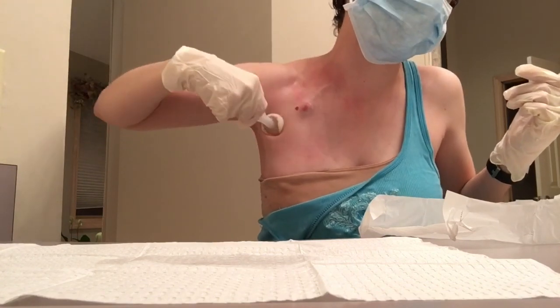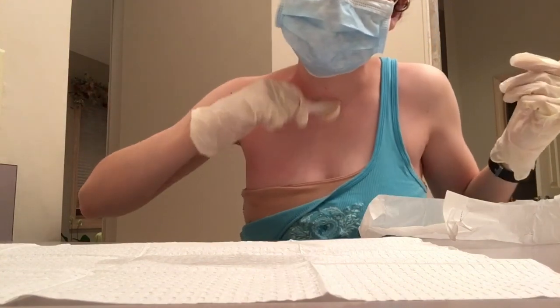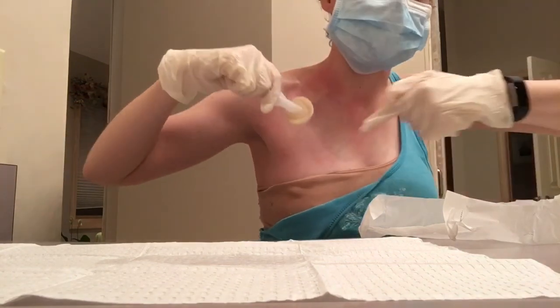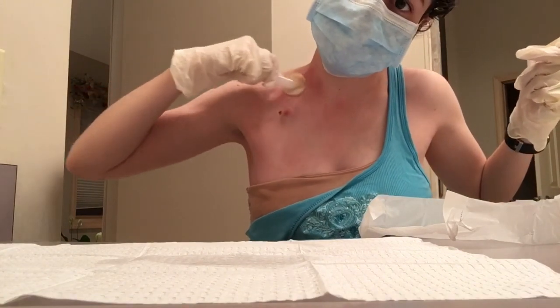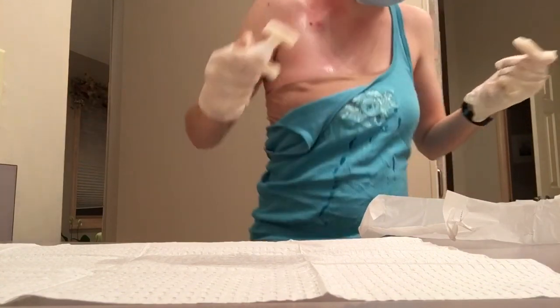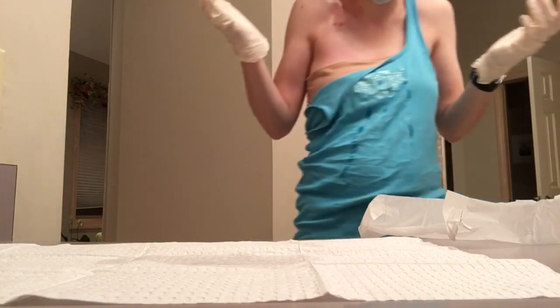So I make sure to get by my armpit all the way up by my neck and actually towards like the middle of my chest. And I have to make sure it does not touch my clothes because then it would not be sterile and I would have to open another one. So that is done. Throwing that in the sink. Now I have to wait for it to dry.